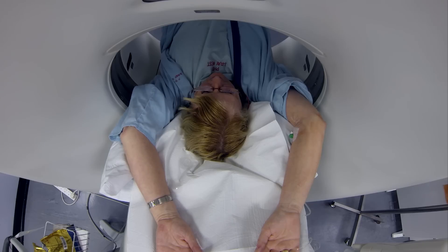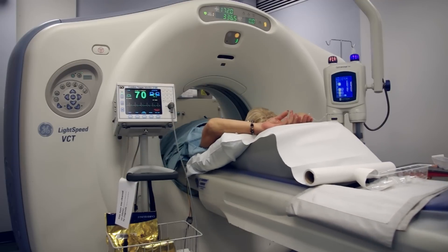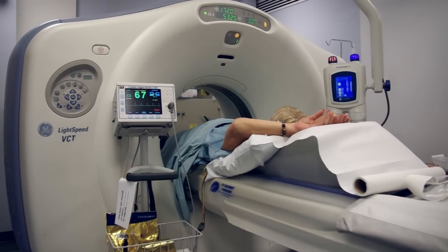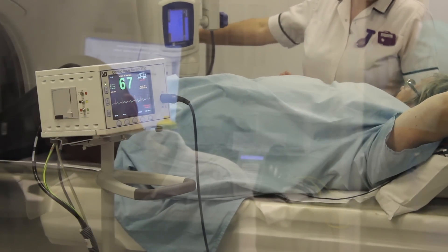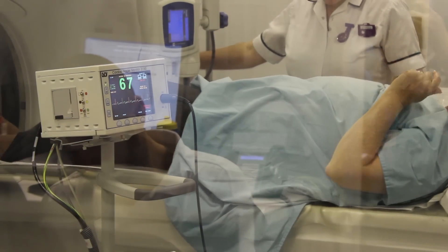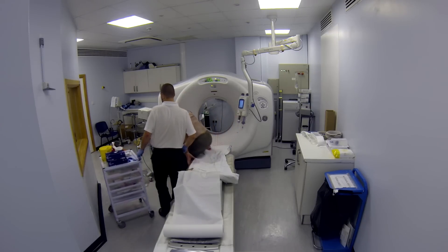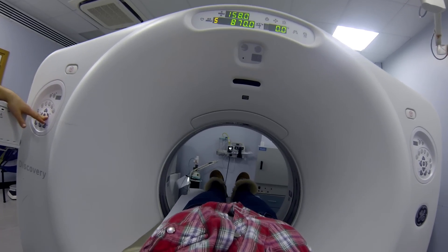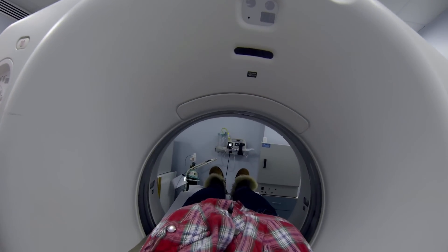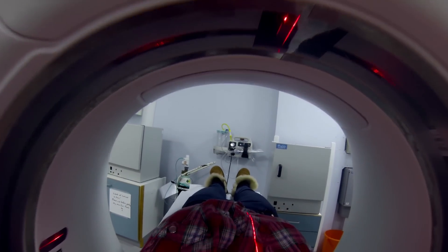If you breathe during the scan or your heart rate is too fast, we might need to do it again. If not, that'll be the end of the scan and you'll be free to leave the room. The results will be sent to the doctor that requested the test. We'd like you to stay in the department for about 10 minutes after the scan, or 20 minutes if we've given you beta blockers. It's important that you bring your medicines on the day of your test, or a list of what you're currently taking, so we can make sure it's safe to give you beta blockers and x-ray dye.